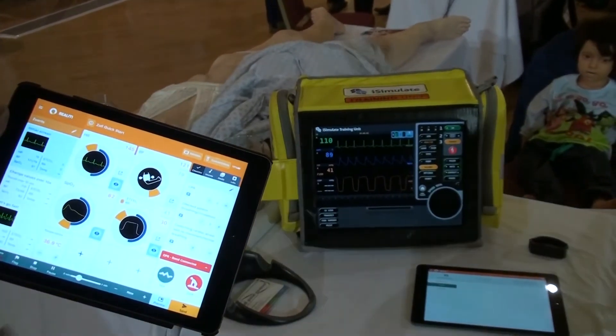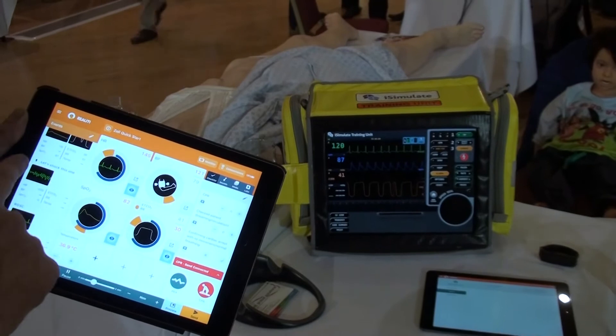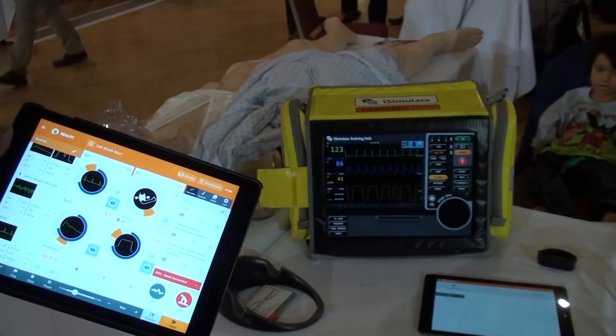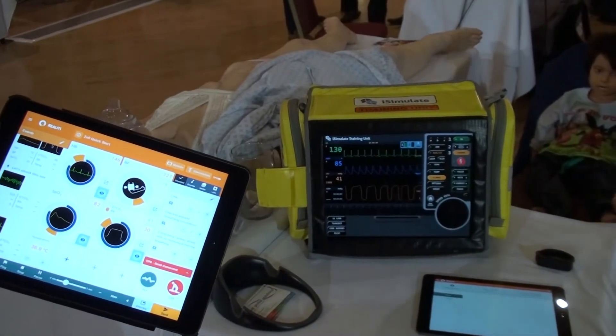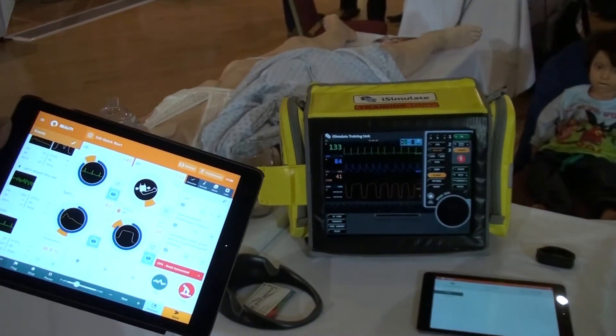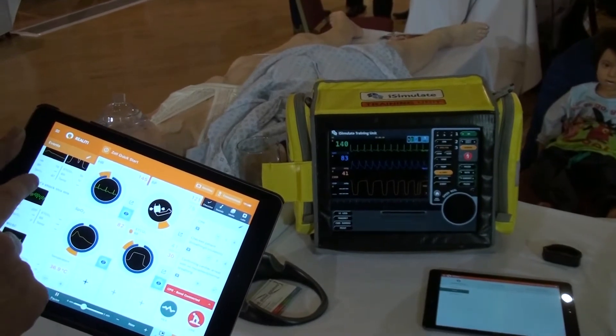When I'm ready, I can throw the patient into VF. I've got VF here as a rhythm, so when I feel the time is appropriate, I will shove the patient into VF.